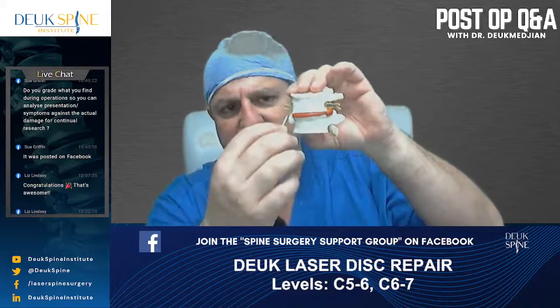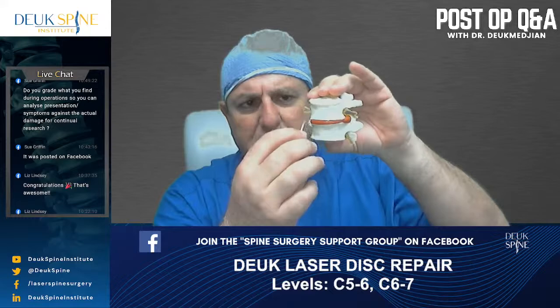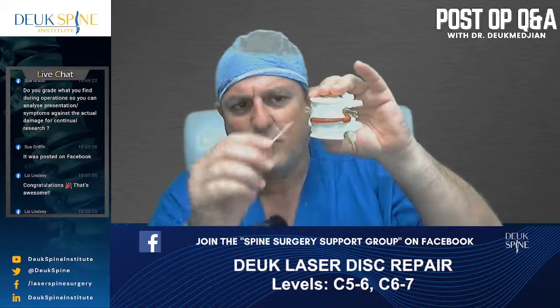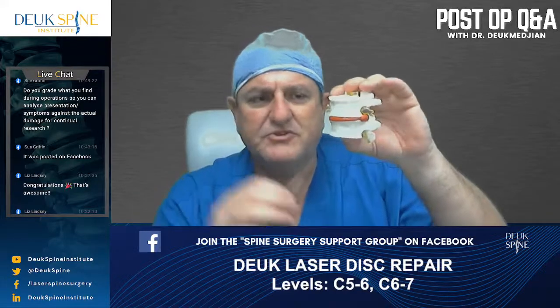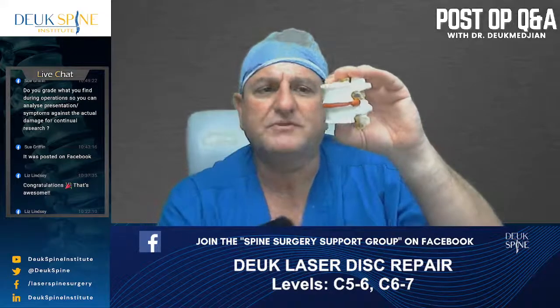Typically we do an ACDF or an artificial disc. That's been the standard of care for years. We would go in and take this whole disc out just to get to the piece in the back. Once you've removed the disc, there's nothing between the bones but air. So you have to put a cage in there and a metal plate to hold it together, or you put an artificial disc.